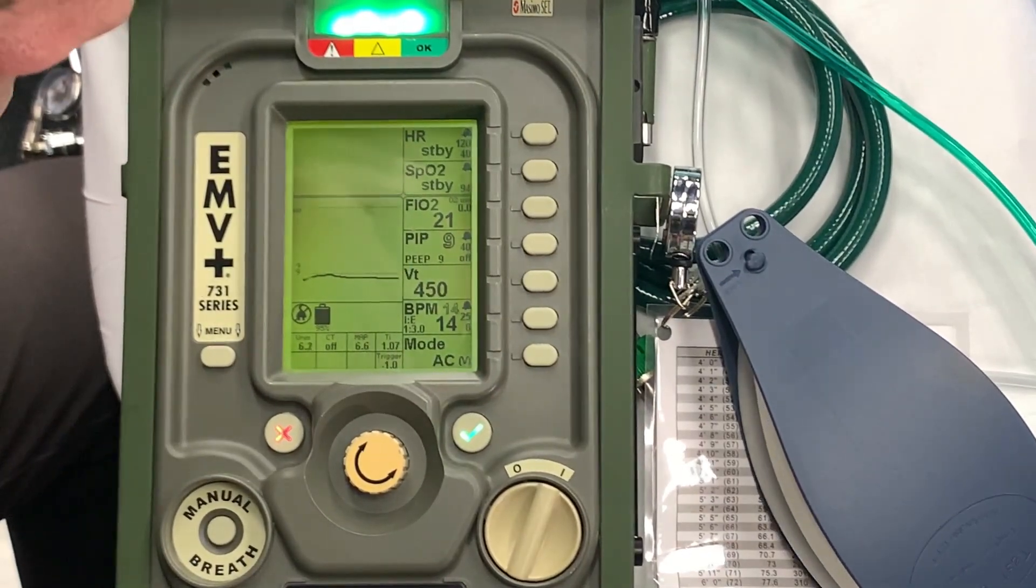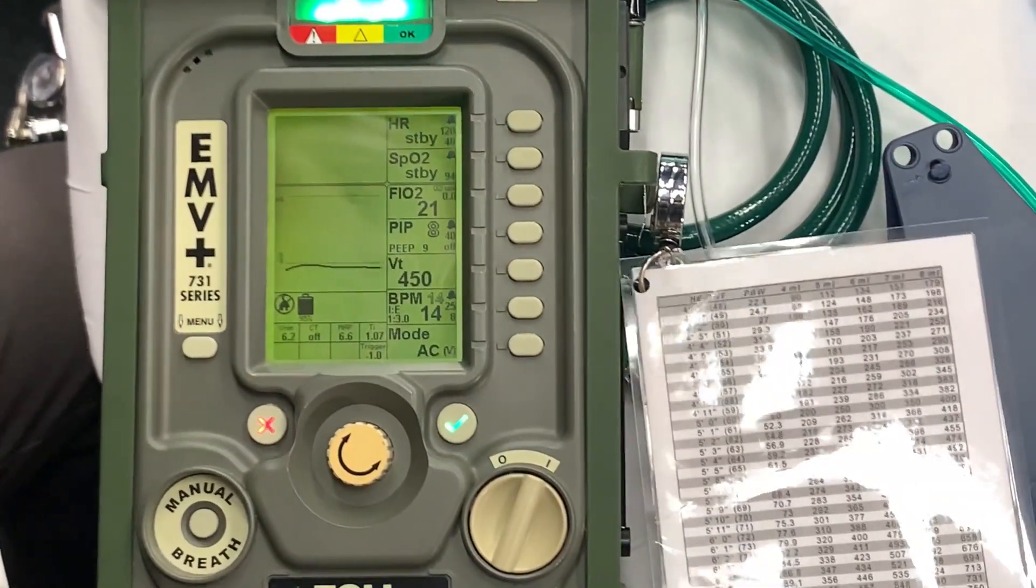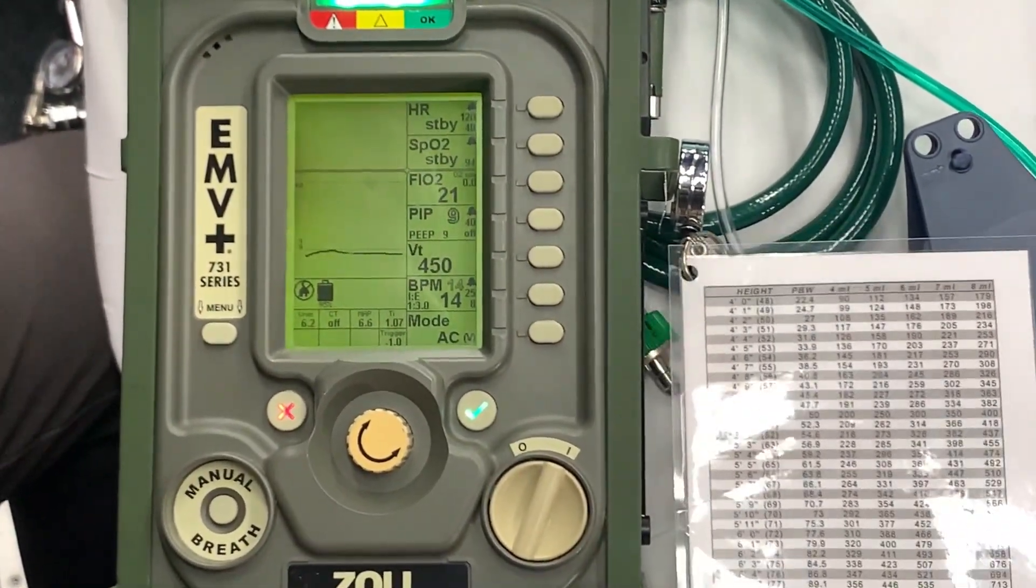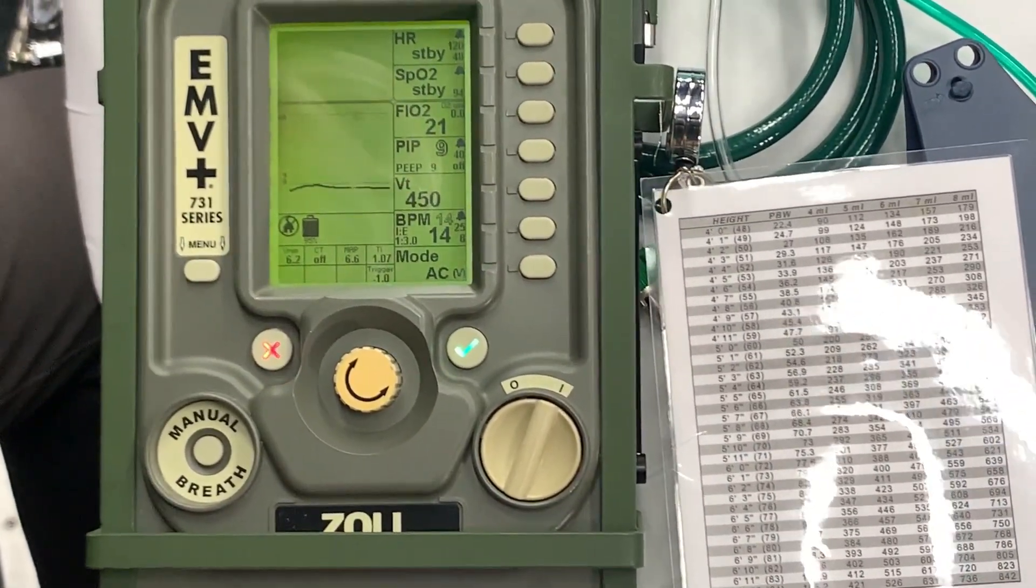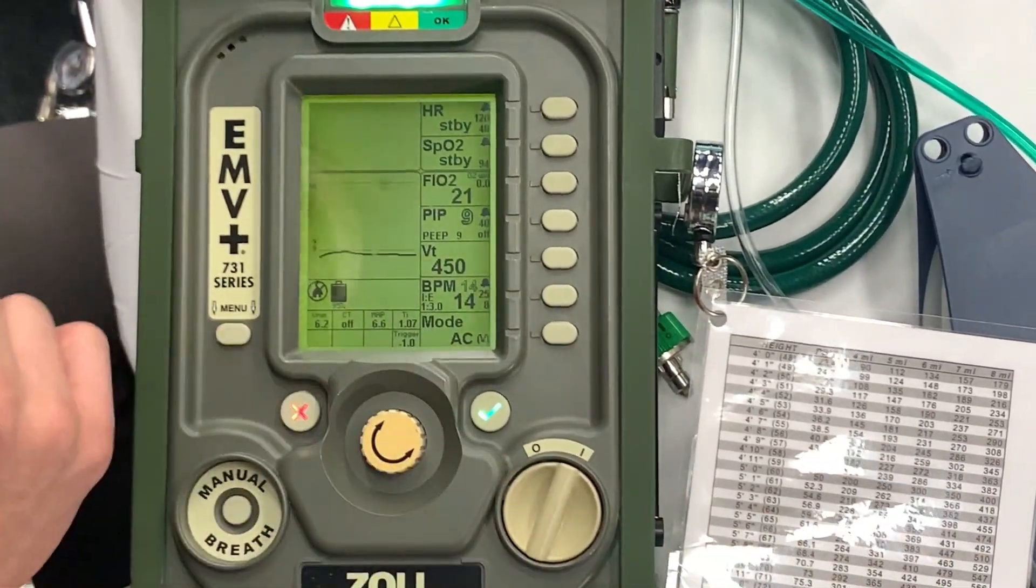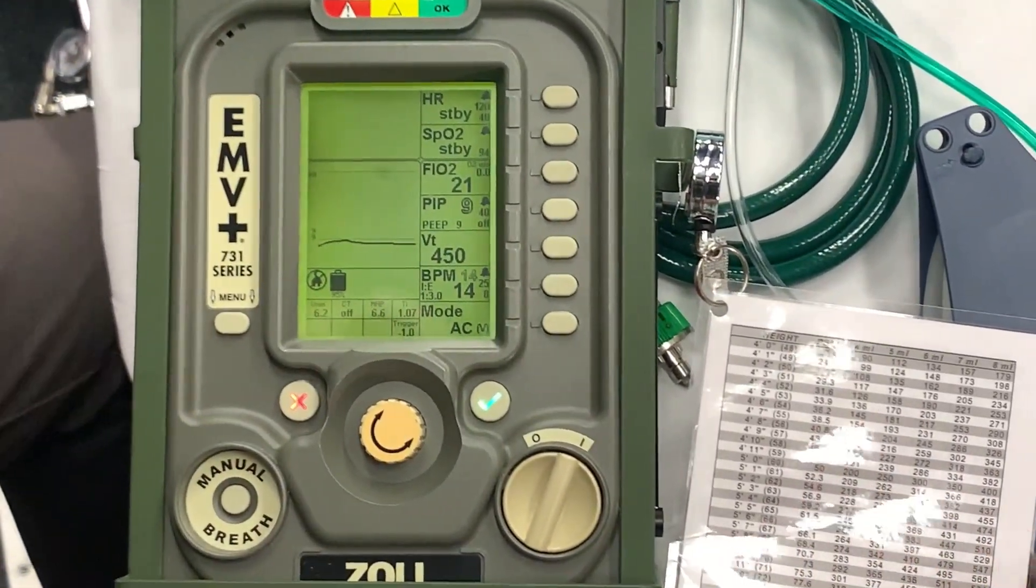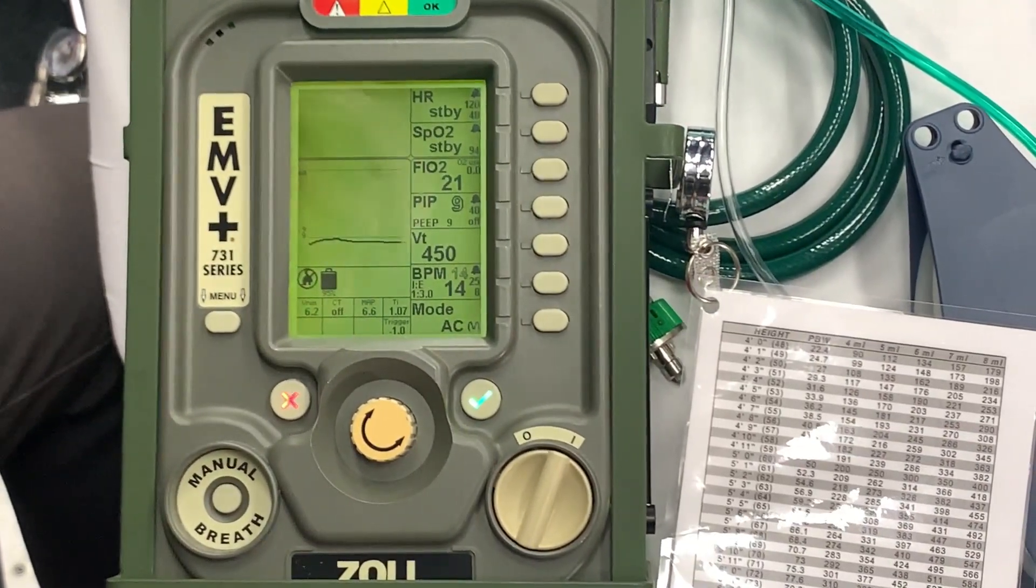An ideal body weight is something that we like to carry a good chart for. This is why we have this attached to our ventilator right here. This is for males. Now this other side we have for females, it changes. And we set our tidal volumes based upon four all the way up to eight cc's per kilogram of that patient's ideal body weight.